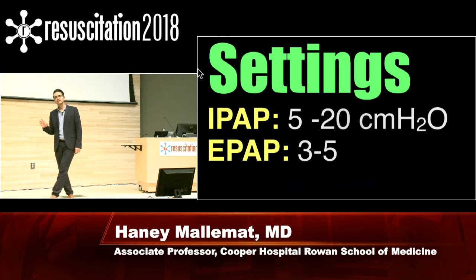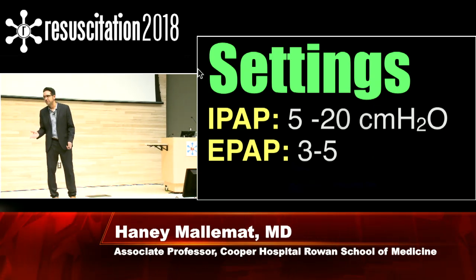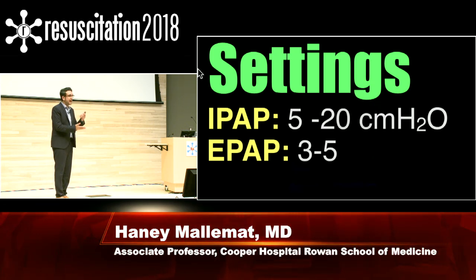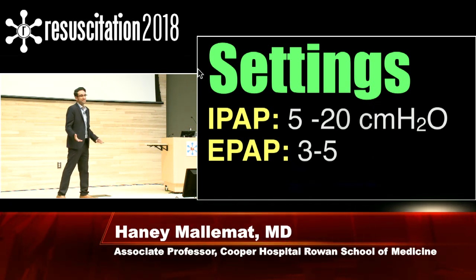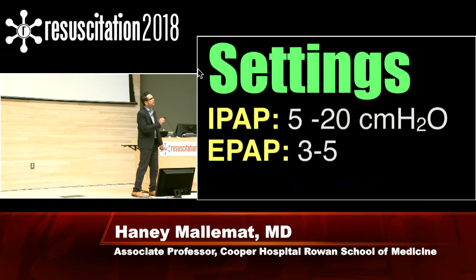Every once in a while, I'll find somebody who has a real problem with this. They say, you have to give them PEEP. I say, you don't have to give them PEEP. They say, you have to give the patient PEEP. So I put them on EPAP of 1. All right? You asked for EPAP, I gave you EPAP. The point is if they have no trouble with oxygenation, there's no need to give them the EPAP.